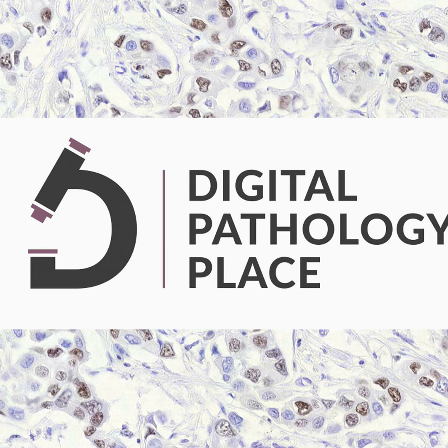So when do you think everybody else is going to start using DICOM? How long do you think it's going to take pathology to adhere to a unified standard? Well, the other vendor that's approved in the United States, Leica, already uses DICOM in its next generation product. And DICOM is the format that they will be putting out by preference. They can, of course, encode it in their legacy format, their SVS format. But it's got DICOM built in from the start.